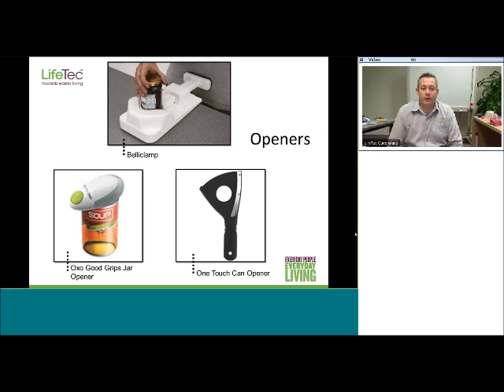It retails for approximately $45 and can be used to open cans without any hands being used. It sits on top of the can and rotates around. It adheres to the can using a magnetic strip. Another useful aid for opening cans is the Brix J popper. It can be used to lever open ring pull cans and retails for approximately $13. You'll find other ring pull openers on our database through our website as well.